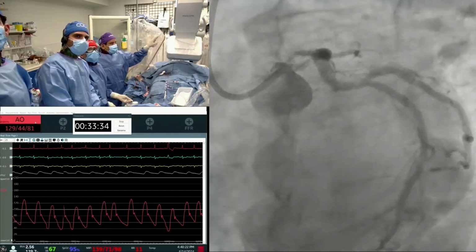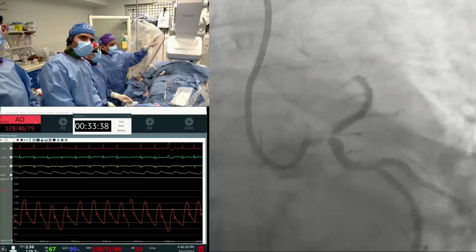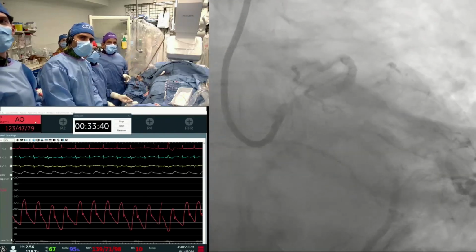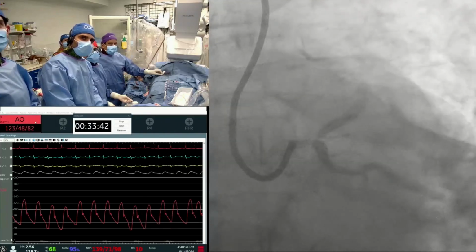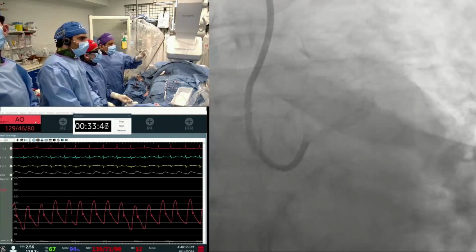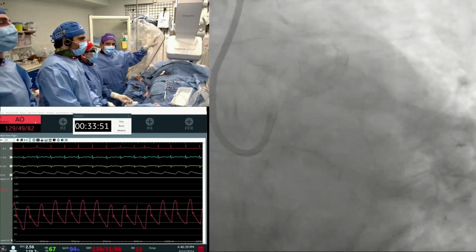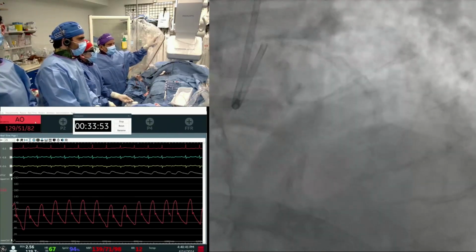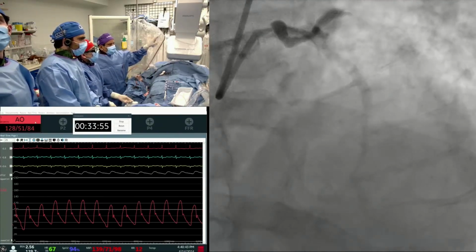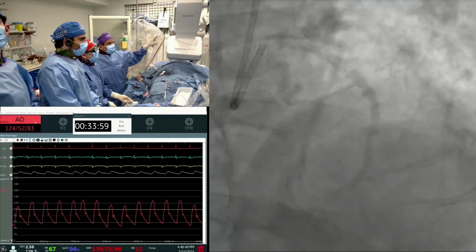And see this very significant left main, very much better than 0. This is the case. See, the LAD has a TIMI 2 flow. And why I wanted to come back: the patient came in with a blood pressure of 80 and a very calcific 95% distal left main, ostial LAD, and of course the circumflex, maybe a little bit of ostial disease. And you see the TIMI 2 flow in the LAD, and so TIMI not 2 but 3 minus.